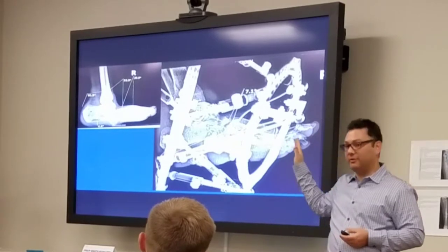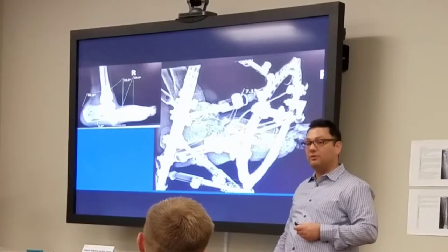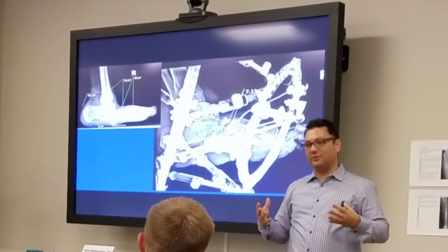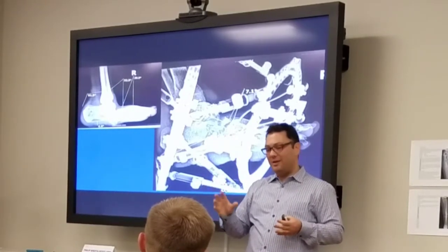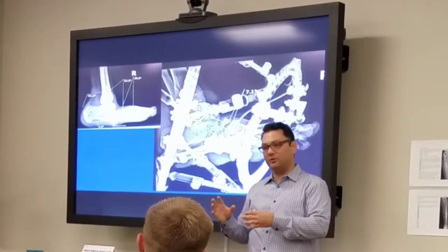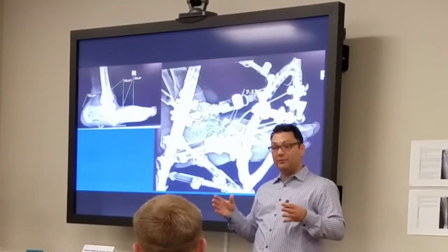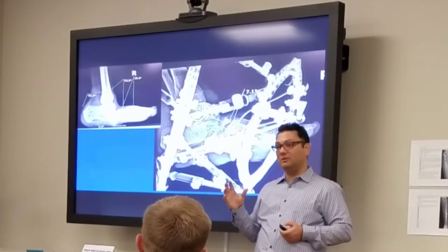and my usage of the hexapod systems and any of them, I don't need to do any hindfoot osteotomies. If you think about it, and you can argue with me if you want, there's really no bony deformity in the hind foot. We're not talking about ankle, we're talking about talus and subtalar joint, calcaneus. Everything's soft tissue contracture, and you can really correct all that soft tissue contracture with hexapod. The question is how you fixate it afterwards is a different story. It means you have to go in there and do subtalar joint fusion and whatever, but you can correct everything with the hexapod. You don't really need to do osteotomies.